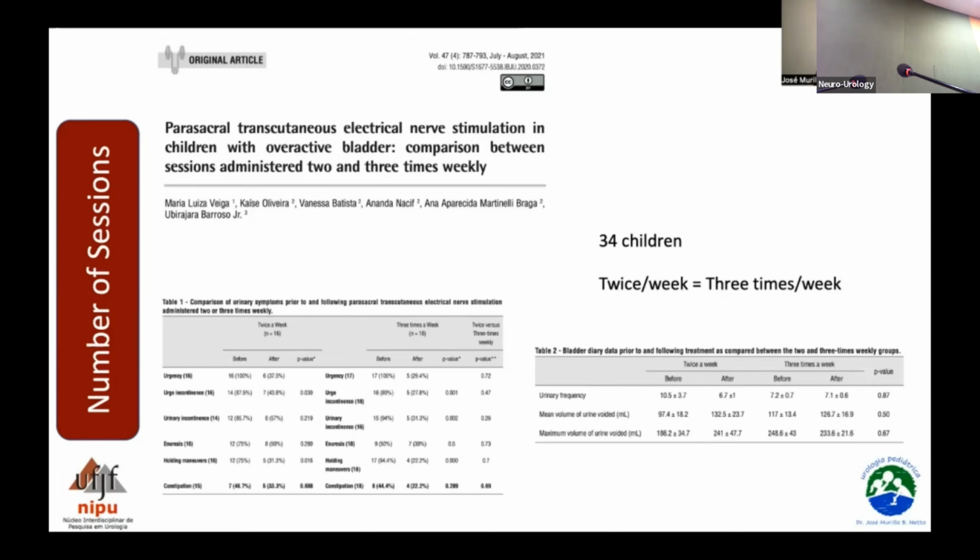So this is one study that we are starting to do now, comparing home neuromodulation to office neuromodulation, and see how it goes, see if there's any difference, and also see which one is better, and if you can do any one of them.